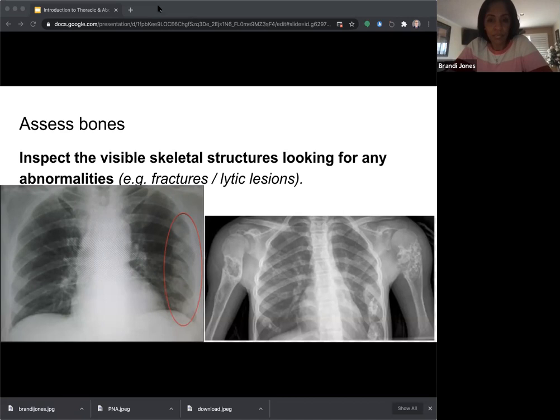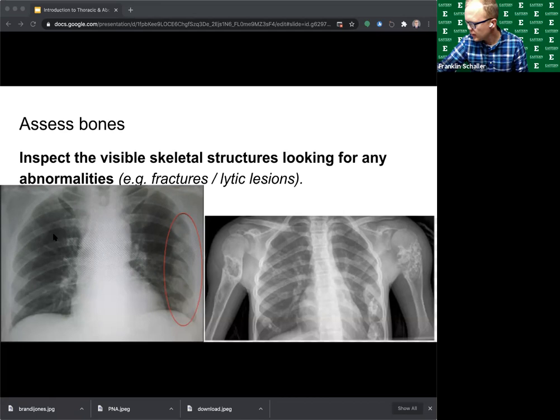So Eva, thank you for chiming in. Fracture, Tina, rib fractures on the left, Kristen, Christina, everybody's saying fractured ribs. Tina sees perhaps a hemothorax. So on this image, I am seeing multiple contiguous rib fractures on the left-hand side. So this patient is gonna end up requiring admission to the hospital if they're not already there because of the multiple contiguous rib fractures. In this case, the patient will need continuous hemodynamic monitoring and assessment for further intervention.